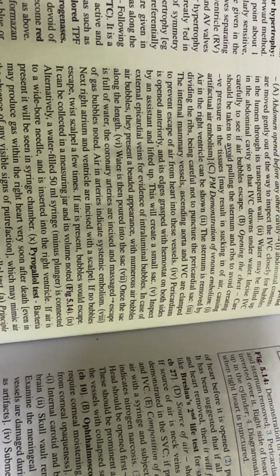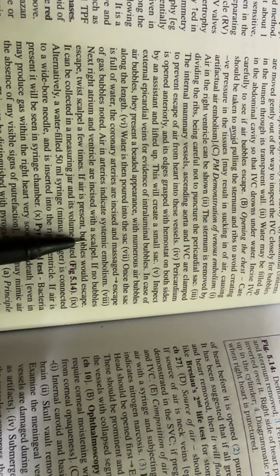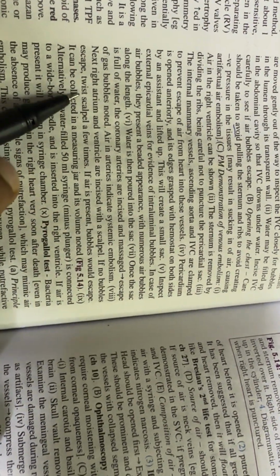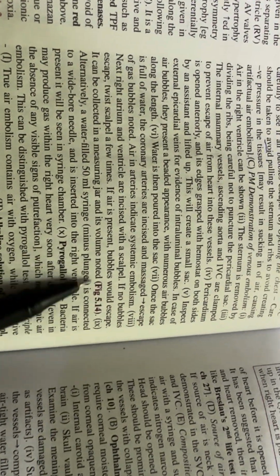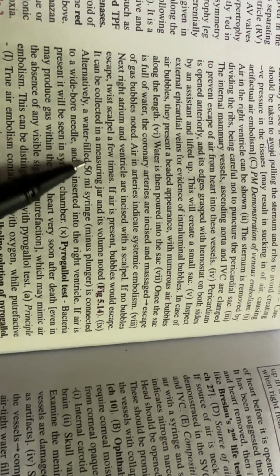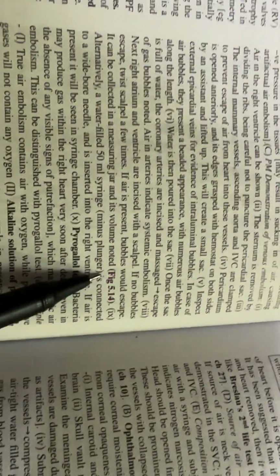Next, the right atrium and ventricle are incised with a scalpel. If no bubbles escape, twist the scalpel a few times. If air is present, bubbles will escape. If it can be collected in a measuring jar, the volume is noted.